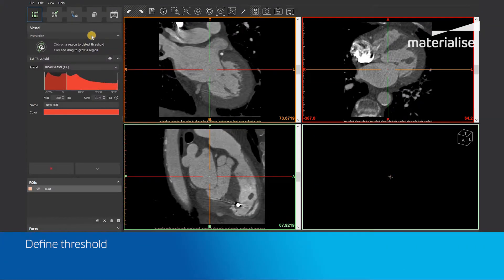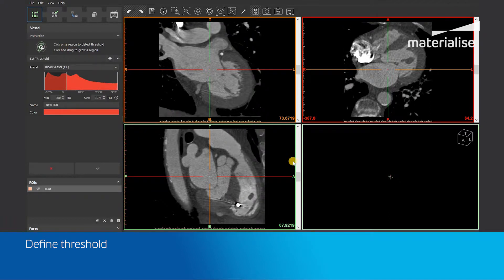Open the Vessel tool. On top, you will see two instructions that explain what you need to do. First, we will need to define the threshold of the region that we want to segment. This can be done by left-clicking with the center of the circle cursor on a region to automatically detect the threshold range of that region.